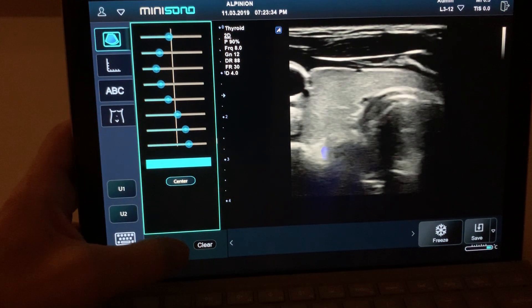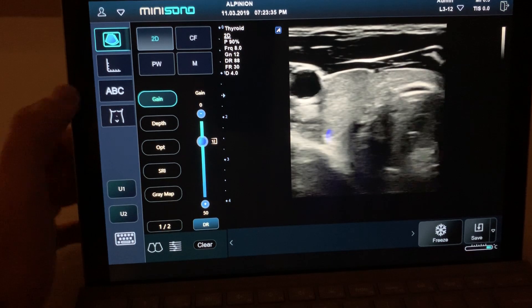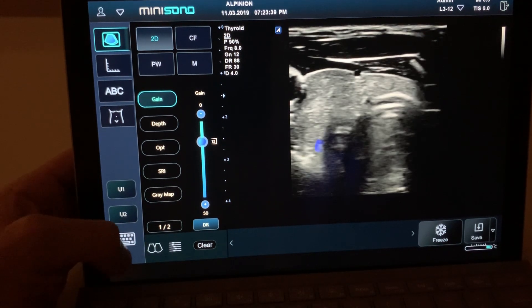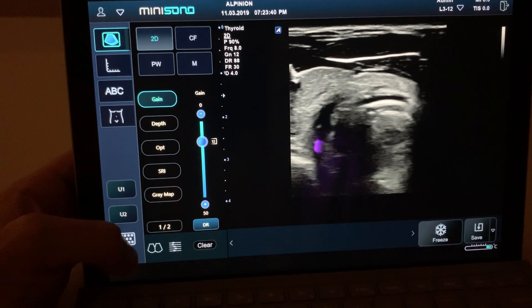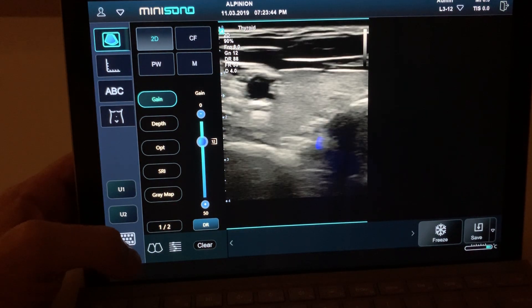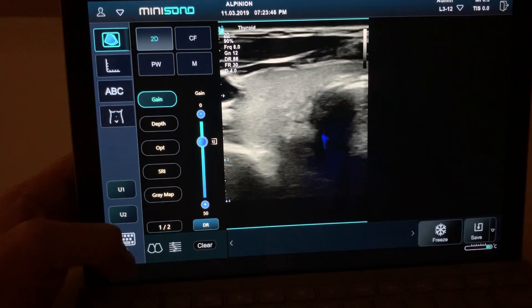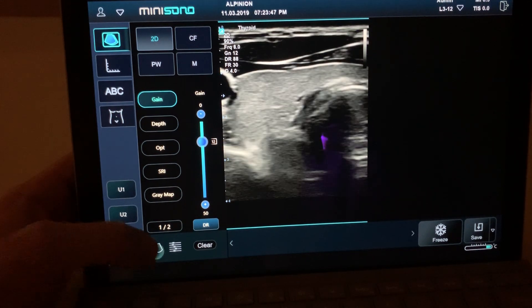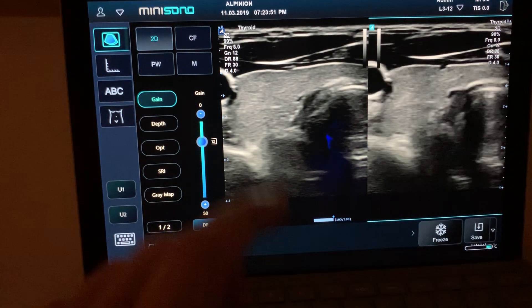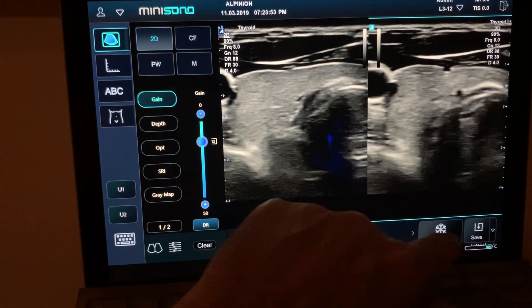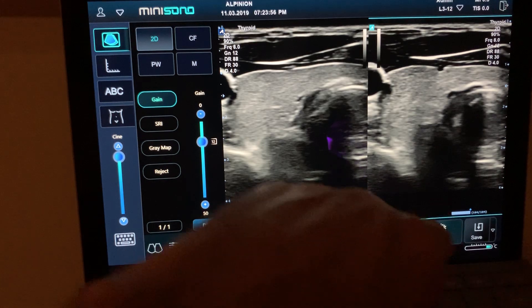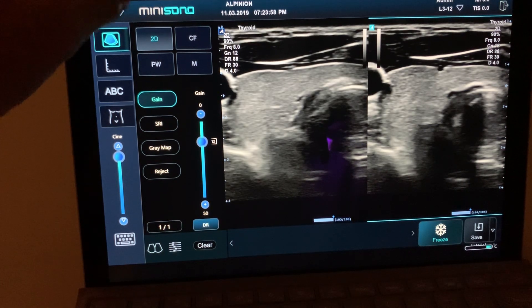Here is where you can do the dual screen mode. When you click it, the screen splits — click again so that first image stays frozen and moves to the next one. When you want to freeze the second one, go to your freeze button and freeze it. If you want to go back to a single image, click back to the single view.